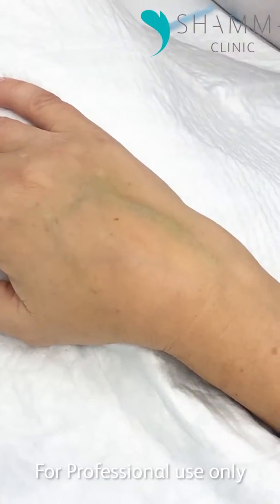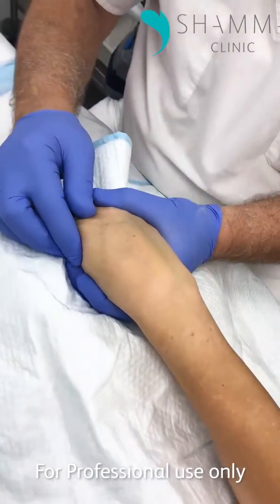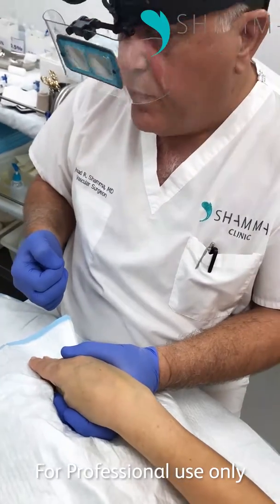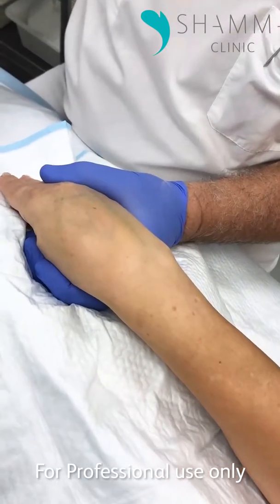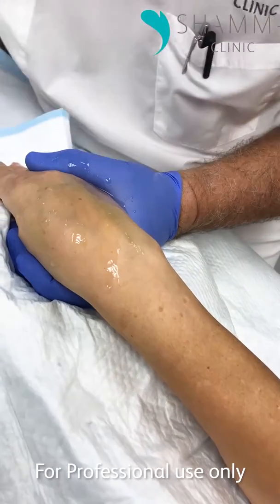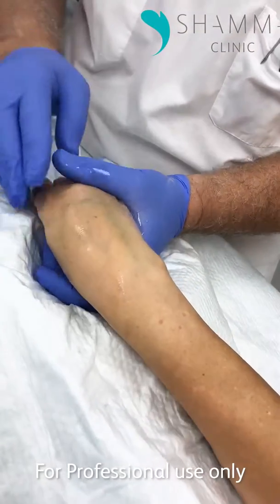There are two ways to treat this. The preferred way and the better way for the patient is we can aspirate it with a syringe and gentle pressure. If that doesn't work or is not satisfactory, then the other technique is to do it with an 18 gauge needle.